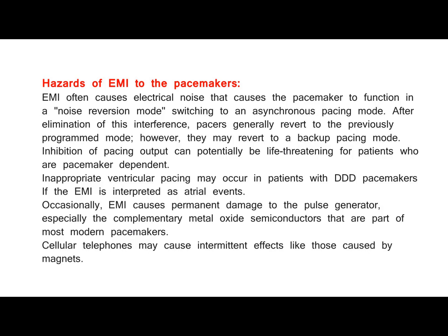Inappropriate ventricular pacing may occur in patients with DDD pacemakers if the EMI is interpreted as atrial events. Occasionally, EMI causes permanent damage to the pulse generator, especially the complementary metal oxide semiconductors that are part of most modern pacemakers. Cellular telephones may cause intermittent effects like those caused by magnets.